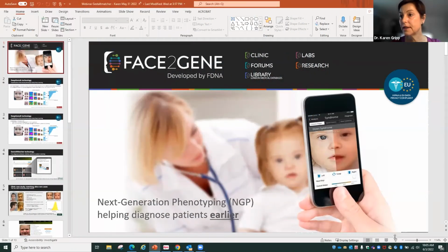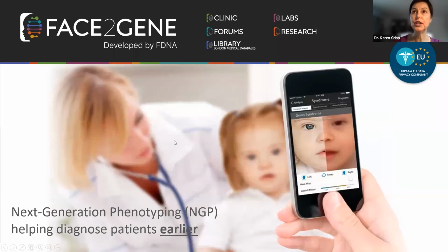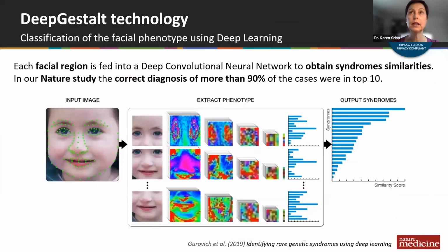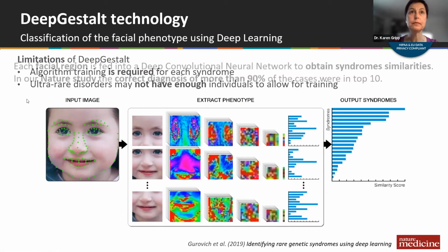I appreciate this opportunity to talk to you about Face2Gene, the app that is provided by FDNA and that many of you already use in clinic. You are probably very familiar with the Deep Gestalt technology. Deep Gestalt is the algorithm that's currently run in Face2Gene.